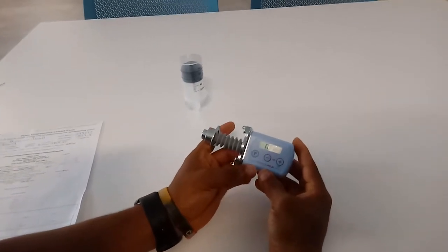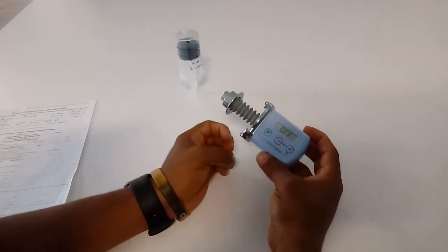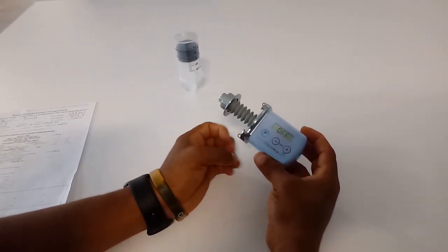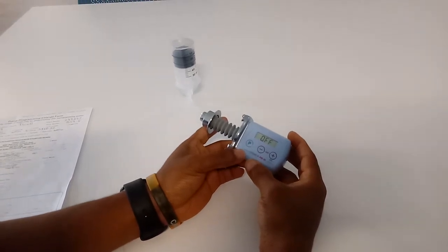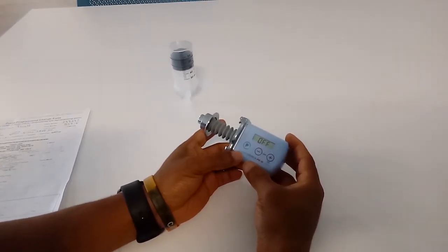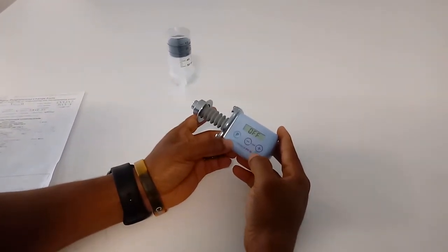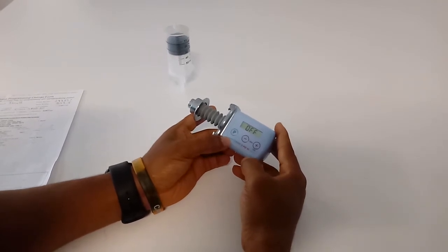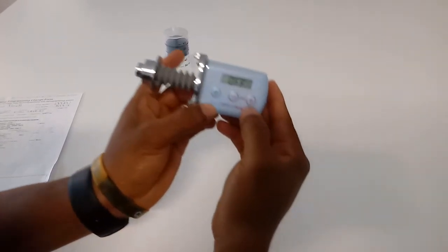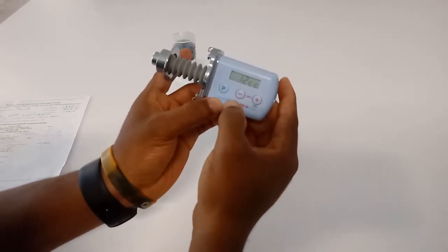All right, so now that our plunger has extended so that it can fit 12 cc's, the pump returns back to the off mode. We're now going to program the time in the on mode. So we have to turn the pump on to be able to program the time, and we're going to be trying to program a 10 hours infusion. So to turn the pump on, you simply press the plus button as you see right here. So I'm going to press that and hold on to it. As you can see, the volume of 12 cc's we programmed.